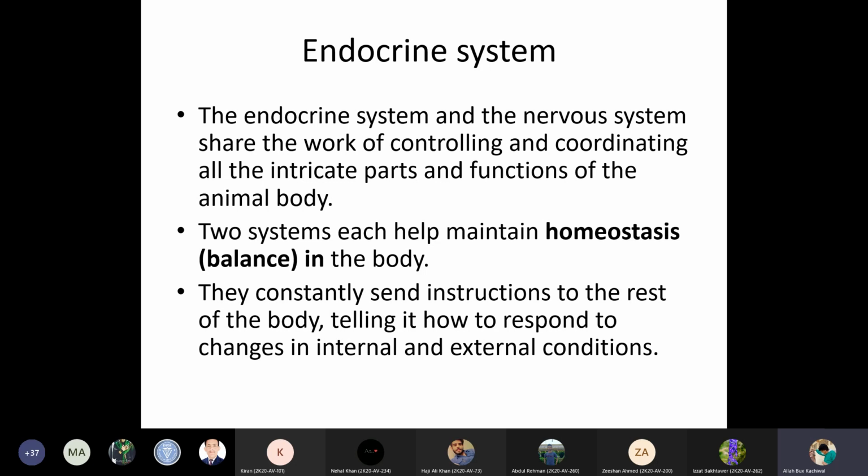The homeostasis means the balance of the internal environment. The status of the internal environment should be brought back. So we are performing to restitute the physiological functions towards the normality. Whenever there is any fluctuation, whenever there is any pathological condition, whenever there is any damage or injury, it has to be repaired and reversed back towards the normal.